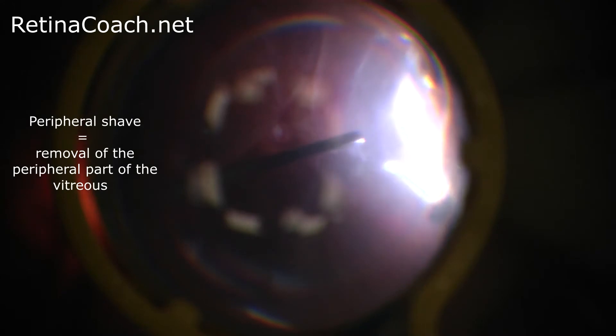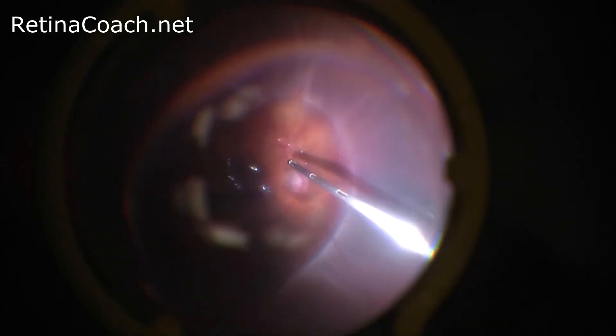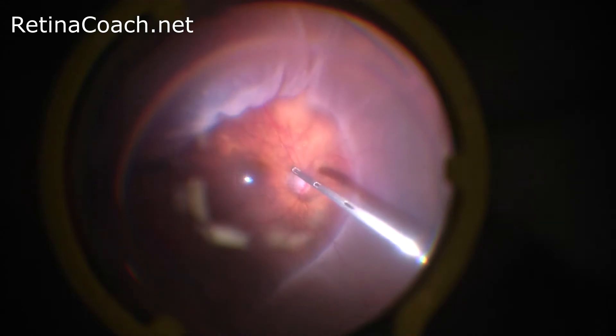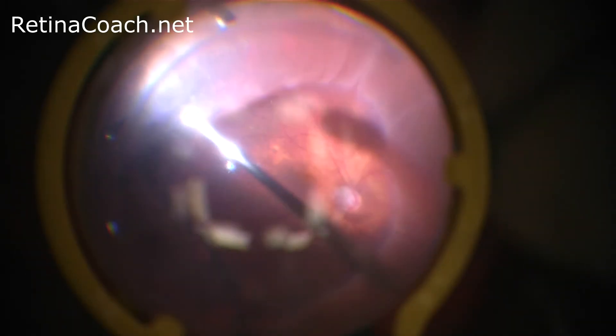In contrast to Core Vitrectomy, peripheral shaving allows release of any peripheral traction over the detached retina from the vitreous base. Thorough removal of the peripheral vitreous can best be achieved with scleral depression, as seen here. Close illumination to the area of shaving and use of triamcinolone are helpful tools for visualization of the peripheral vitreous.